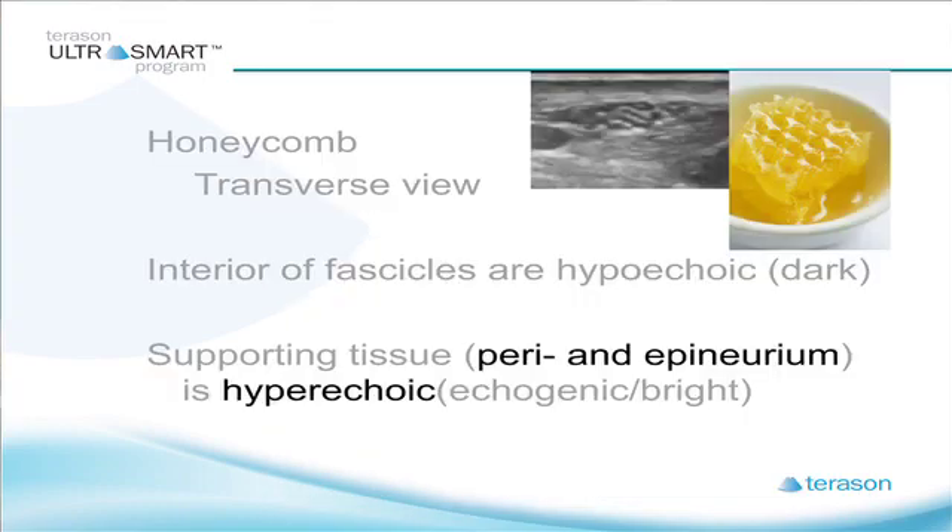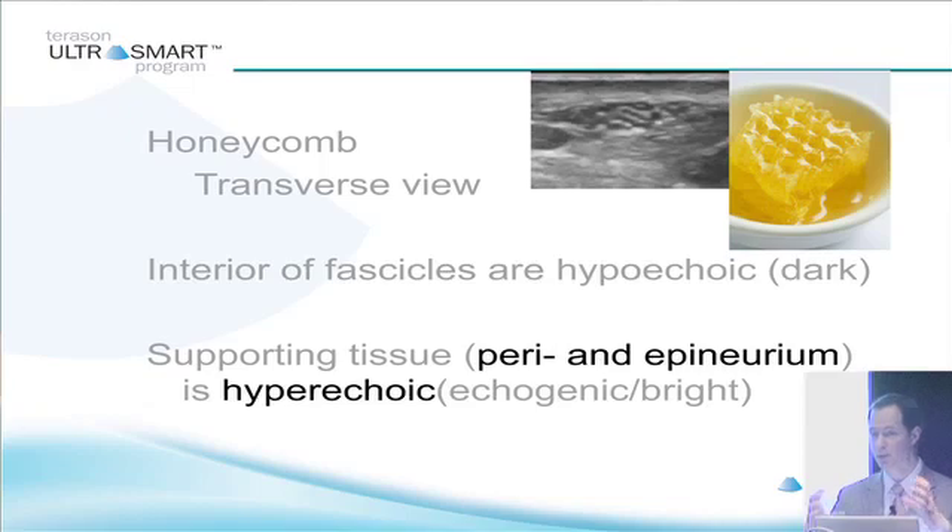A nerve cross-section in transverse looks like a honeycomb. The interior of the fascicles are hypoechoic, but all the supporting tissue — the perineurium, the epineurium — all of that is hyperechoic because it's dense echogenic tissue.